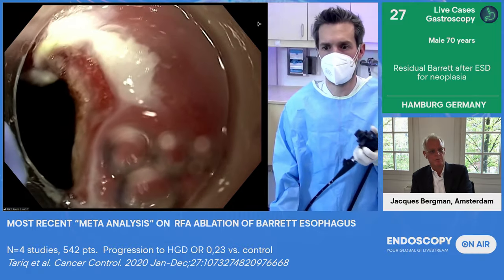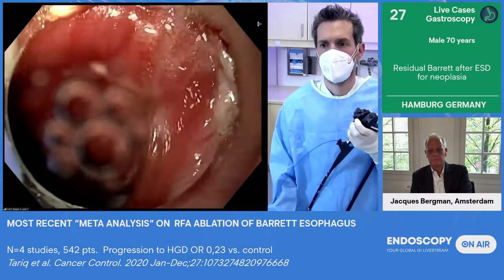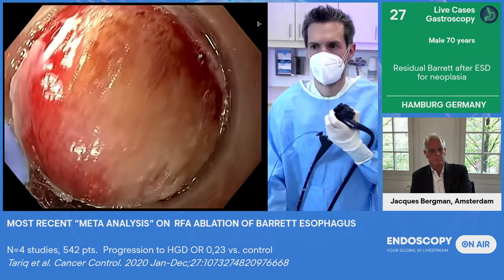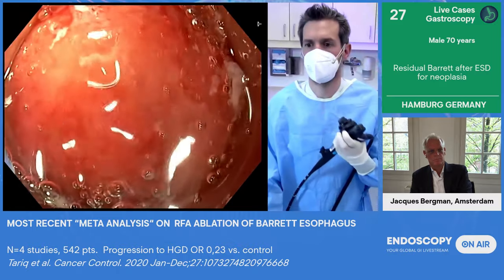First round, there you can see. So I will remain silent. The mucosa, the damaged mucosa. And this is the area we are going to treat with a second round of ablation again. Grab once more. Okay, and then some.